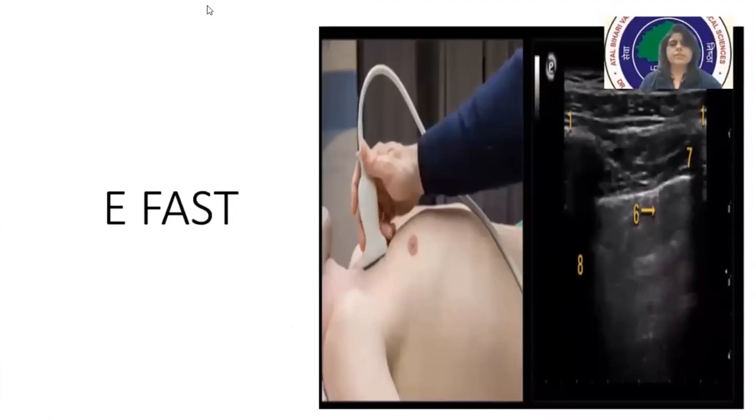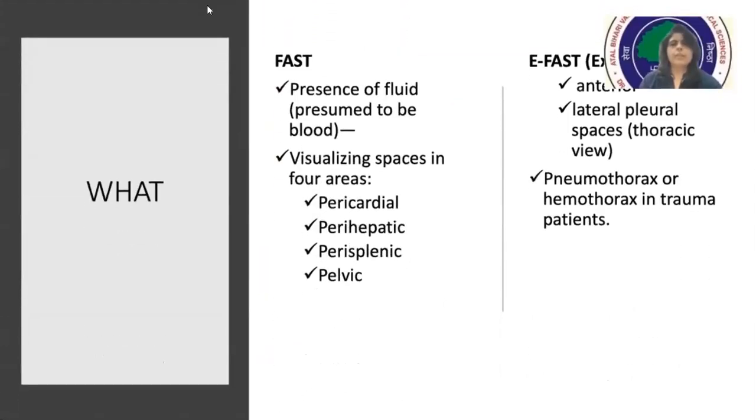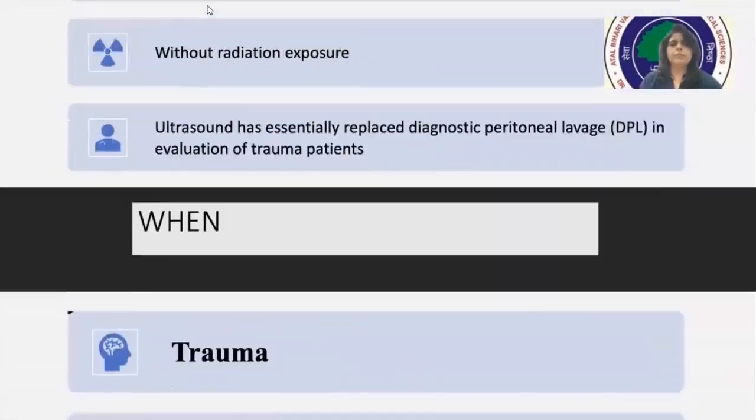Now let's move on to eFAST. eFAST is known as extended FAST. As we proceed, we will answer a few questions: why do we need eFAST, what it is, when do we need it, and how to do it. eFAST is nothing but an extension of the FAST.